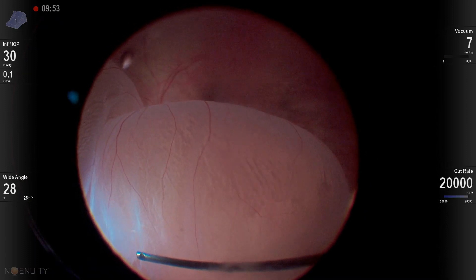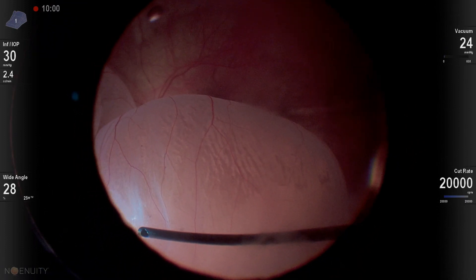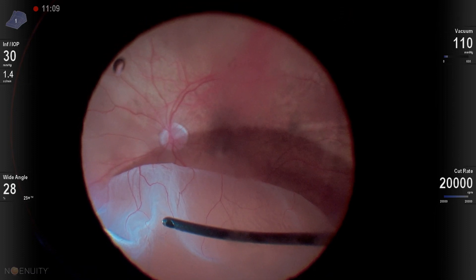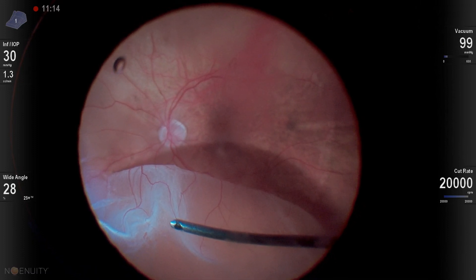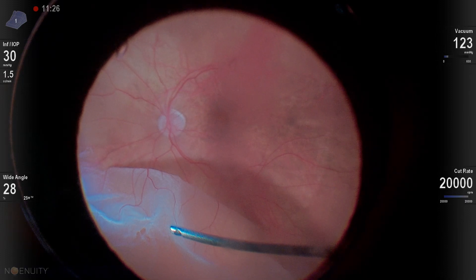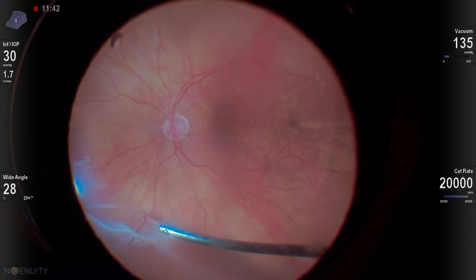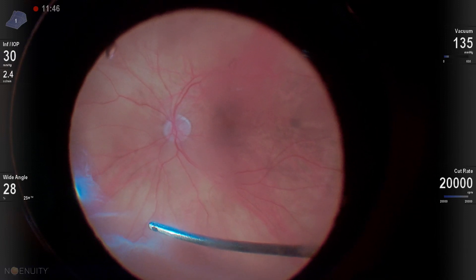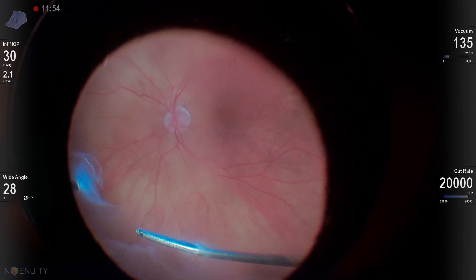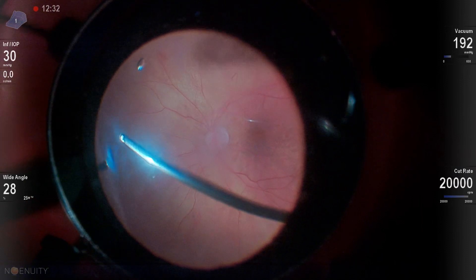My tear was up superior here and I'm shaving over it. I like to utilize low aspiration and high cut rates with this dual blade cutter. You can see I'm guarding my cutter with my light pipe — I have my light pipe right next to my cutter so that if the retina wants to jump up, it will hopefully hit the light pipe before getting bitten by the vitrector. I get in the sweet spot, where you can cut over a break and fluid will egress out from underneath the retina. Keep in mind the retina is still bullous and can still be incarcerated within the cutter, so use those low aspiration rates.